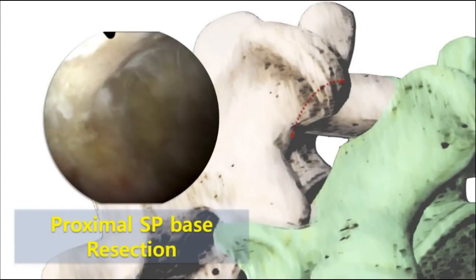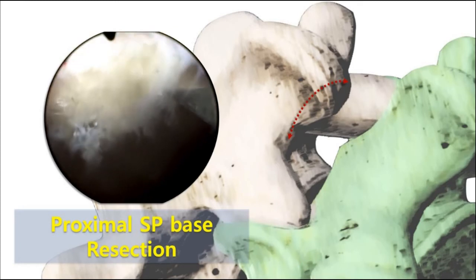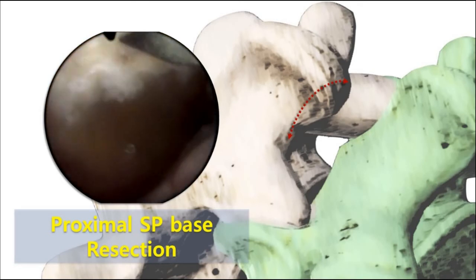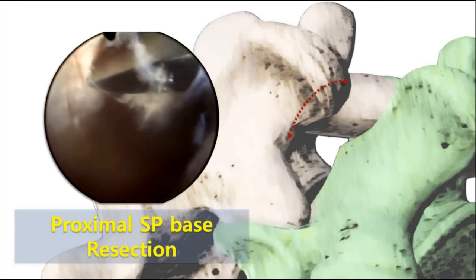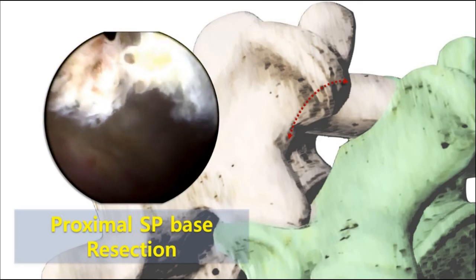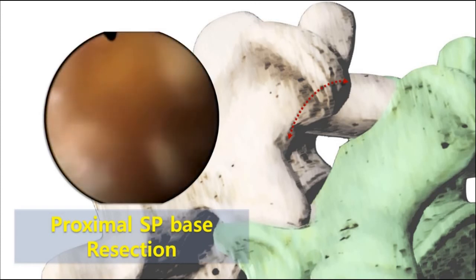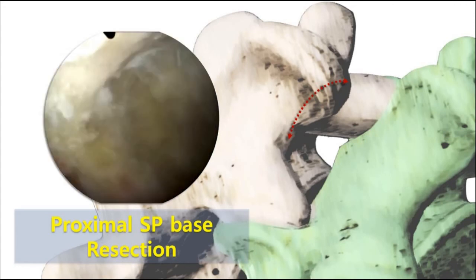In this episode, proximal SP base resection is only explained. First, you should make the first boomerang on the endoscopic view. The scope moving medially on a little backward retrieval shows you the view of the lateral side of the SP base. A straight chisel is located on the edge of the proximal SP base and resects about a 5 mm sized cortical protrusion. When it is done well with enough size resection, the contralateral side area can be seen without being disturbed by the protrusion of the proximal SP base in the middle.